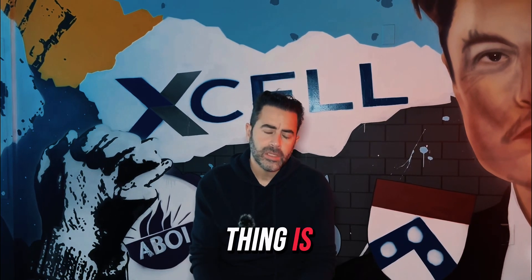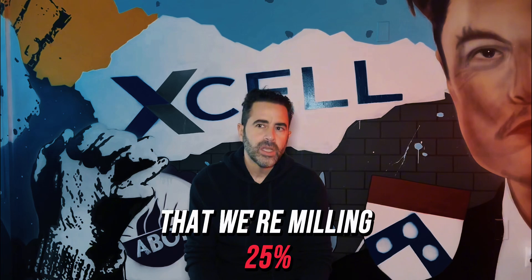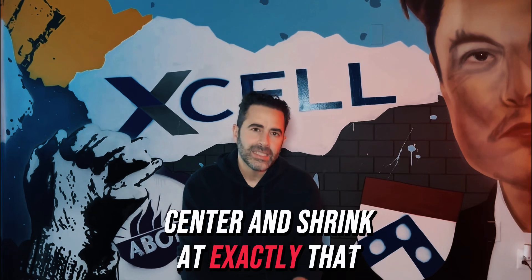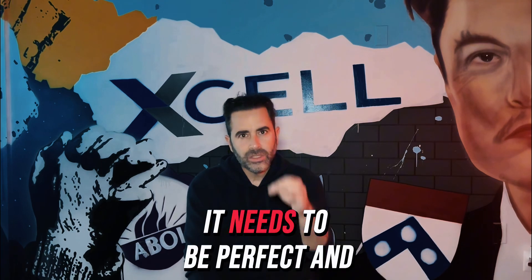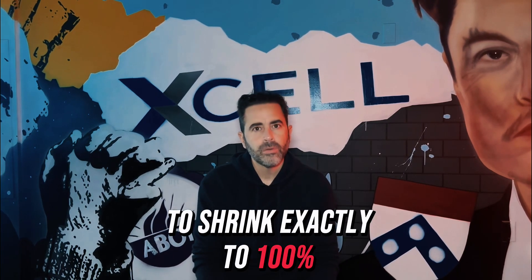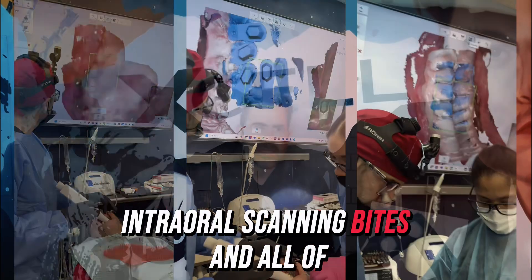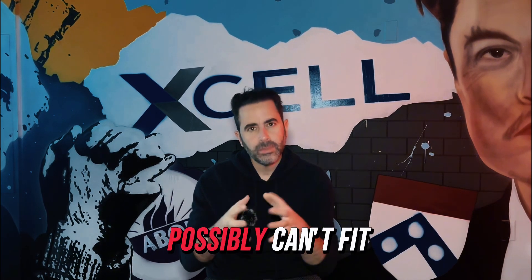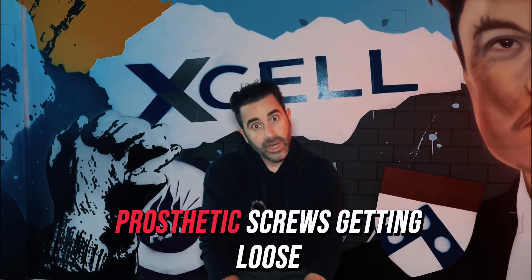The most important issue is that we rely solely on manufacturers to confirm that a puck we're milling at 25%, 23%, or 22.2% enlargement will sinter and shrink to exactly 100%. Because we go direct to the multi-unit with the Powerball screw, it needs to be perfect. We focus so much on photogrammetry, intraoral scanning, and bites — yet we introduce a 25% manufacturing variable that could cause the restoration not to fit.